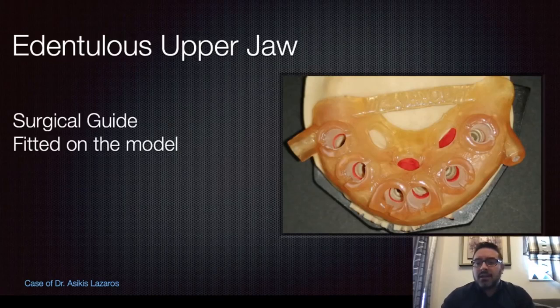And in that case, we proceed to the printing of the digital model that came out of the hardware software. Here you can see the surgical guide fitting on the 3D printed model, and if you look in more detail at the holes, you can see the digital lab analogs, the RP analogs.